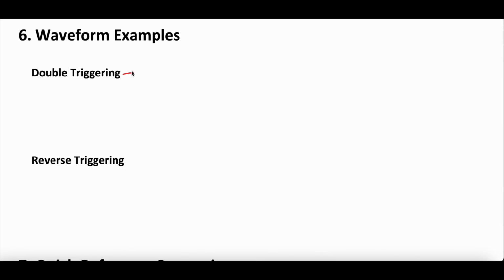So for double triggering, I'm just going to write increased inspiratory phase. For reverse triggering, I'm going to write diaphragmatic reflex, just so that people have those buzzwords to think about while we write them out. We're going to do these scalars based on volume control. And the scalars are waveforms, right? There's pressure versus time, flow versus time, and volume versus time. For the sake of room, we'll start with the pressure scalar here.